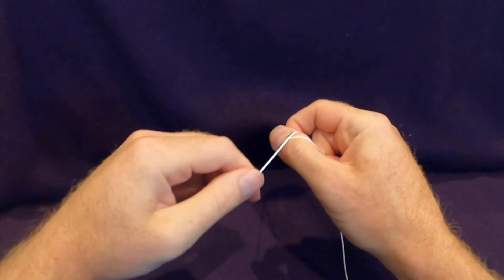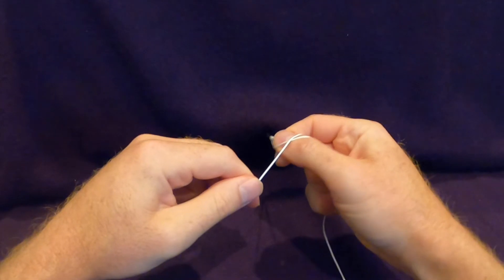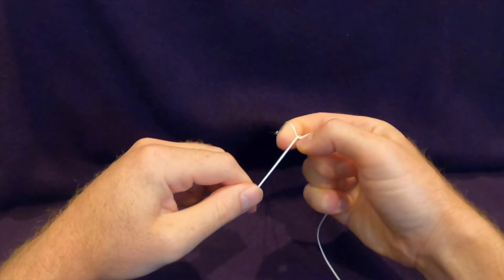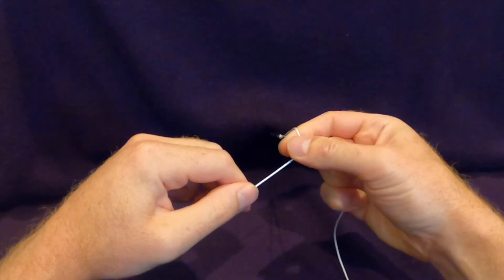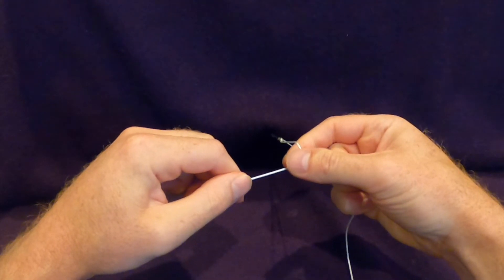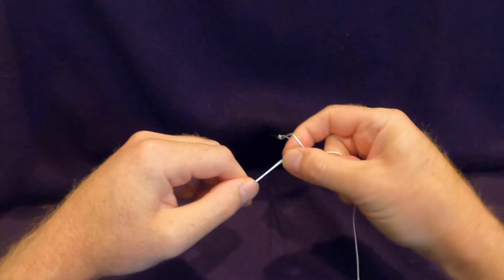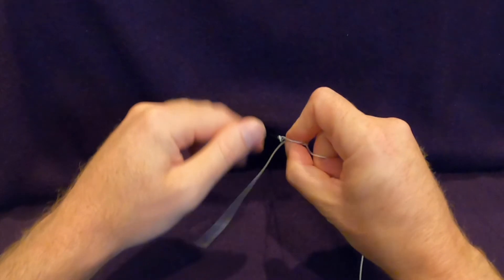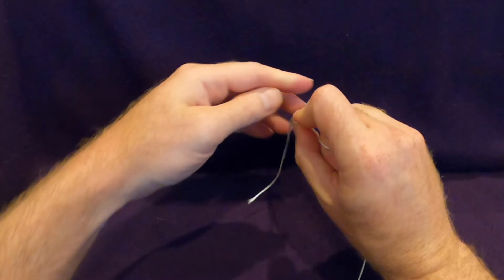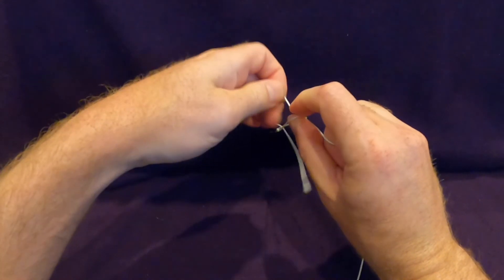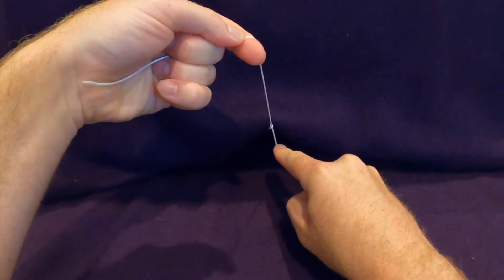Again the suture passes into the C, the fingers close and the hand rotates. The suture that's on the thumb will now pass on to the index finger. Then the suture is grasped between the thumb and index finger and then is passed back through the loop. Next the suture is cinched down and the knot is complete.